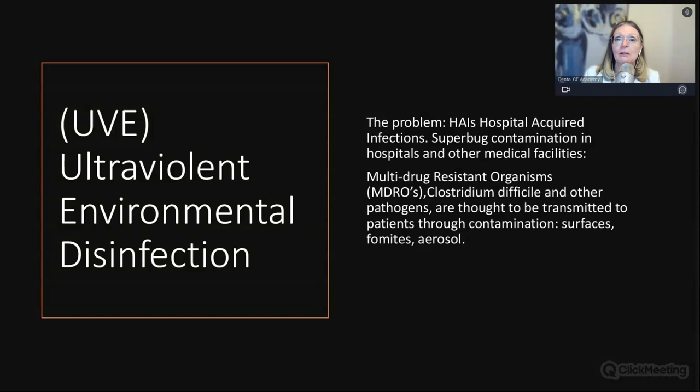So we have to be prepared for the fact that dentistry is procedural. All day long, we are performing these procedures, really like mini surgeries. We're generating aerosol more than any other profession out there. That aerosol contaminates the surfaces, whether they're environmental surfaces or clinical surfaces, and that aerosol doesn't just stay put in the operatory.